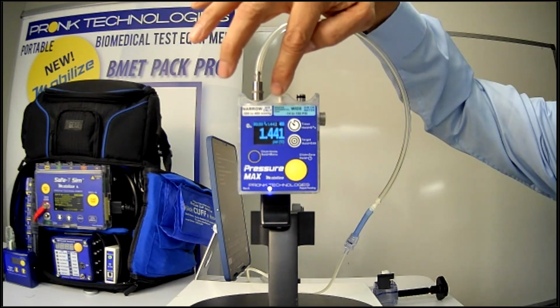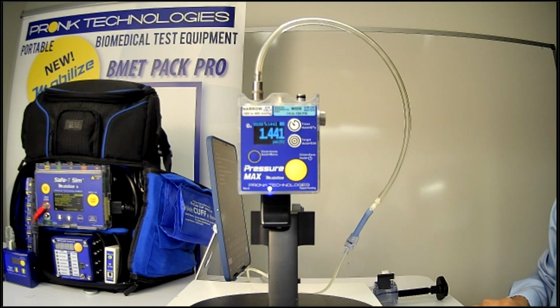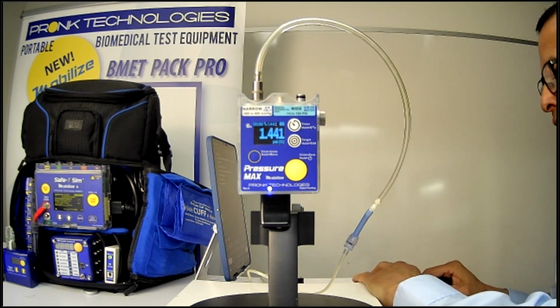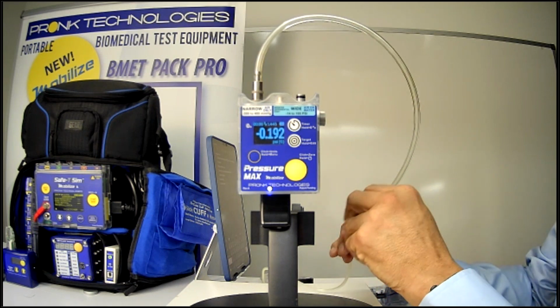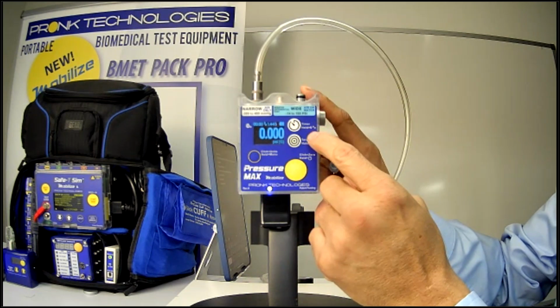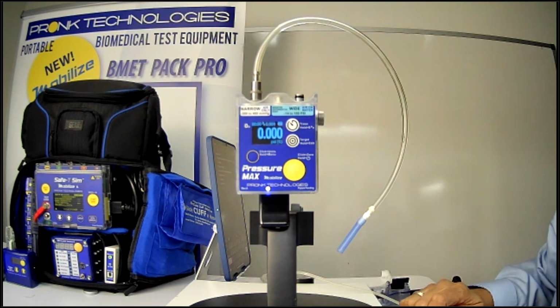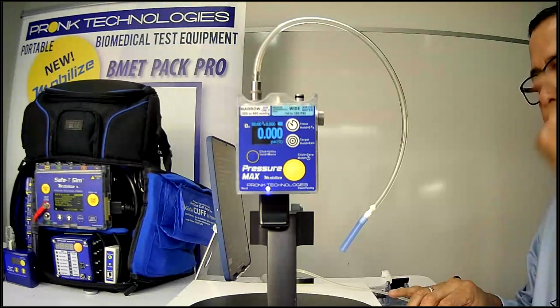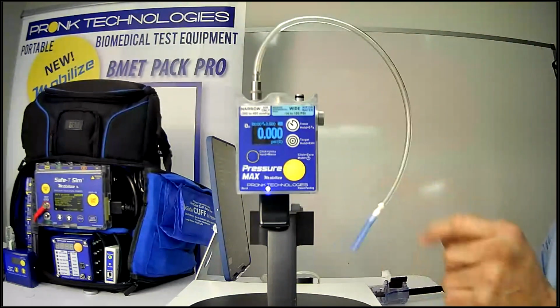You can see here at the top, I captured a peak pressure that's being illuminated there at the top, so that stays and locks in there. I could choose to zero that pressure if I want to by just opening up to atmospheric pressure, and I could press and hold the timer button and just zero out that peak pressure, I should say. So it's really easy to use that narrow port for measuring pressure.